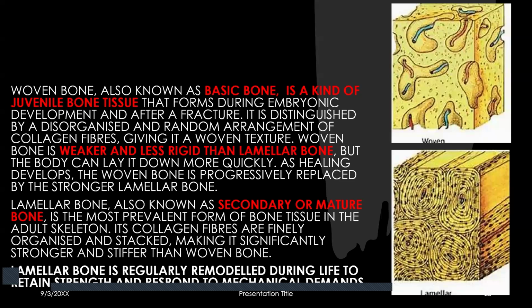But if you make a condition like this, after placing the implant or before placing the cortical implant, that instead of primary healing, there is a secondary healing that happens in a cortical implant. That means instead of formation of lamellar bone, if there is a formation of woven bone in the cortical implant, that implant will lead to failure.